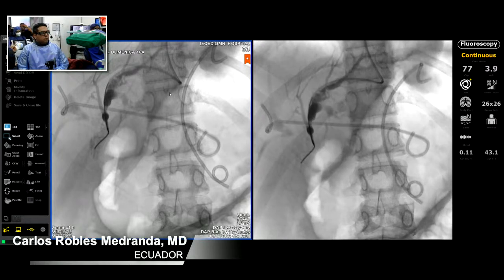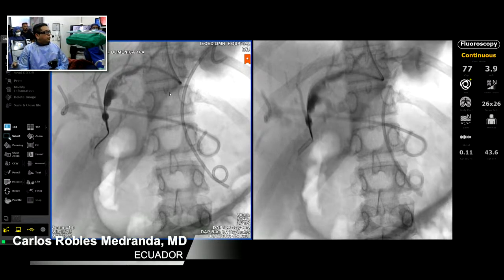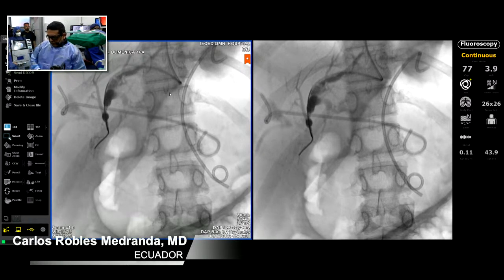Yeah, probably. Yeah, not so sure. Yeah, probably. And now it's draining both sides. Yes, there's a communication. Yes.